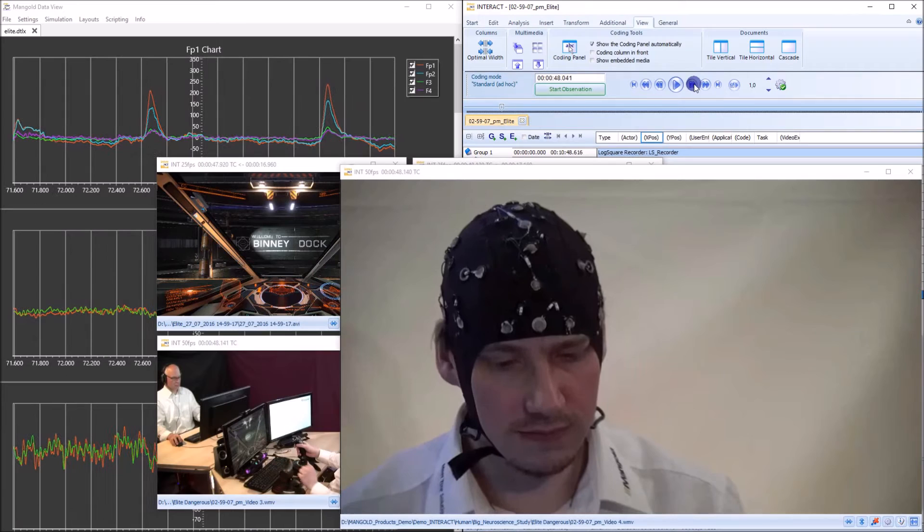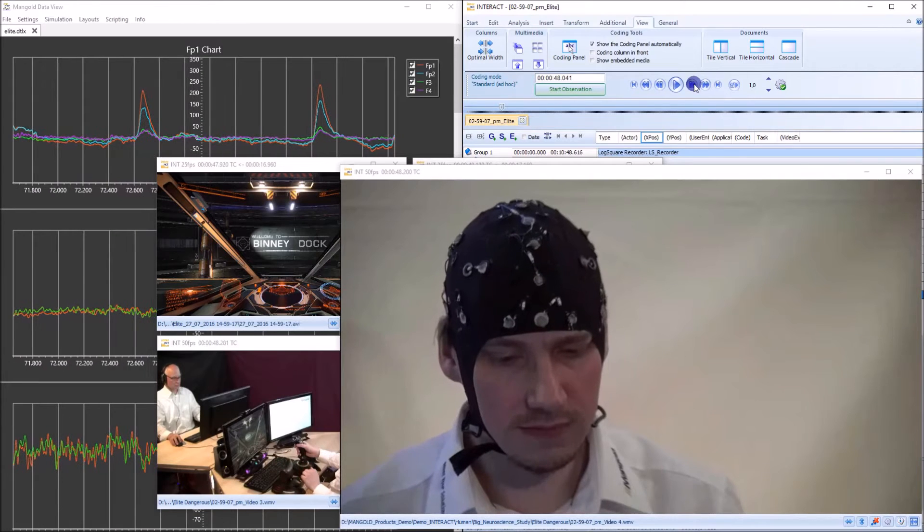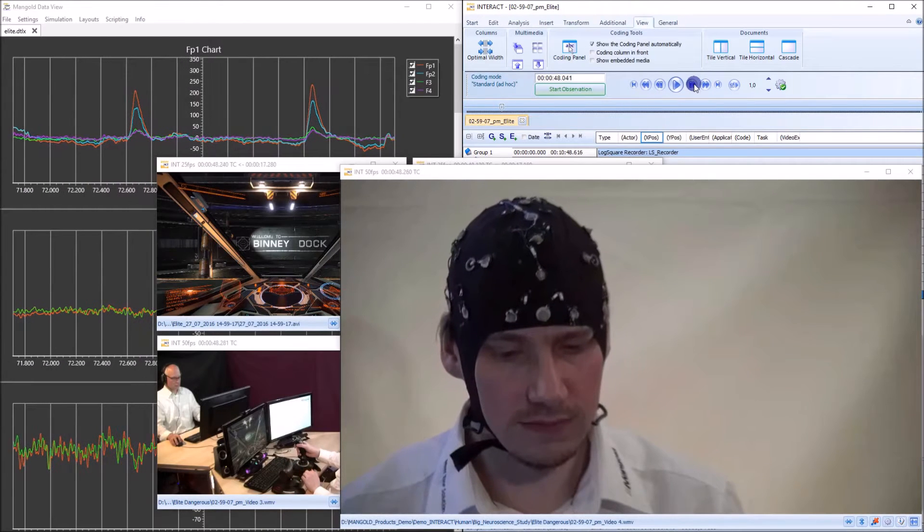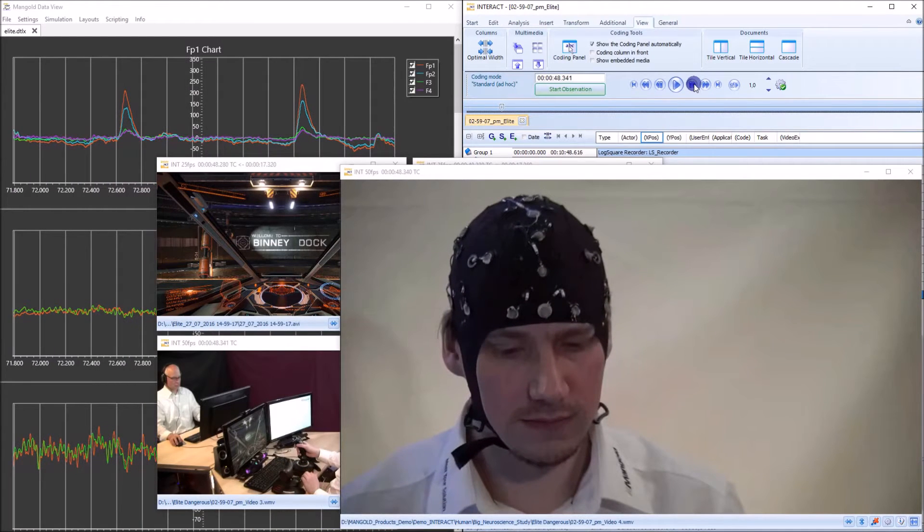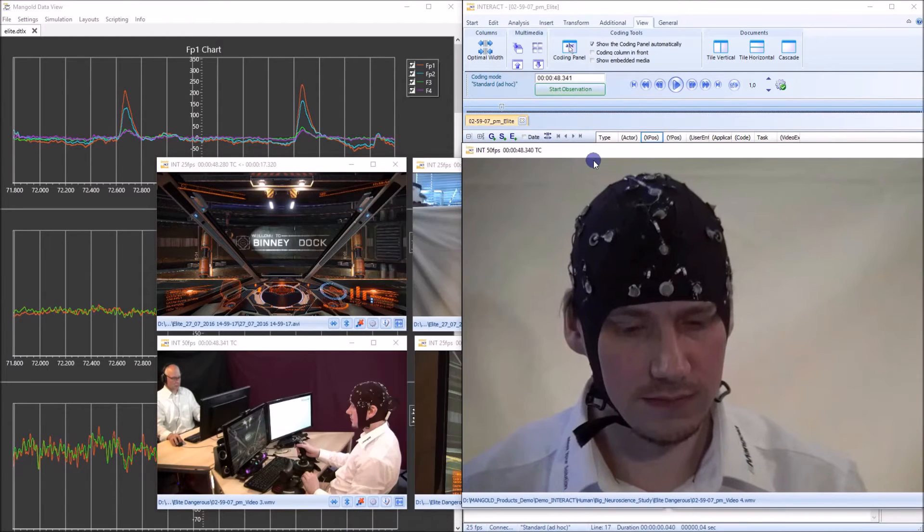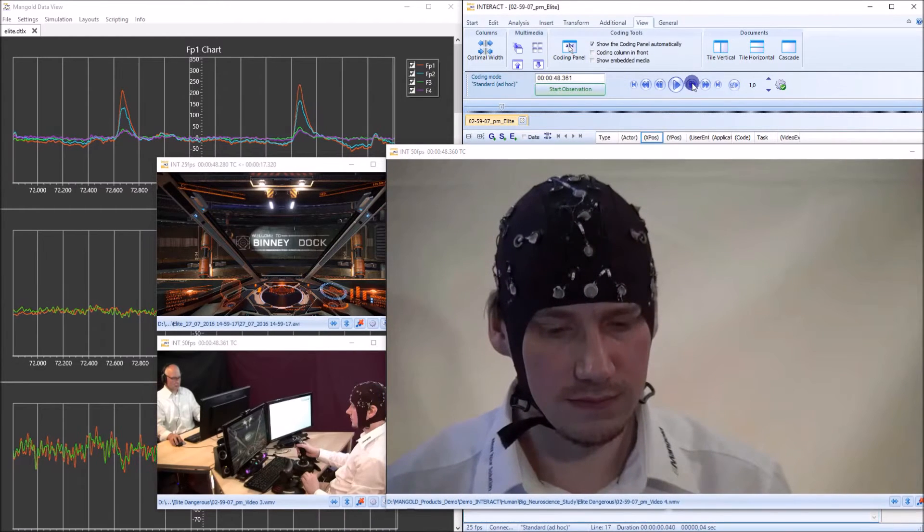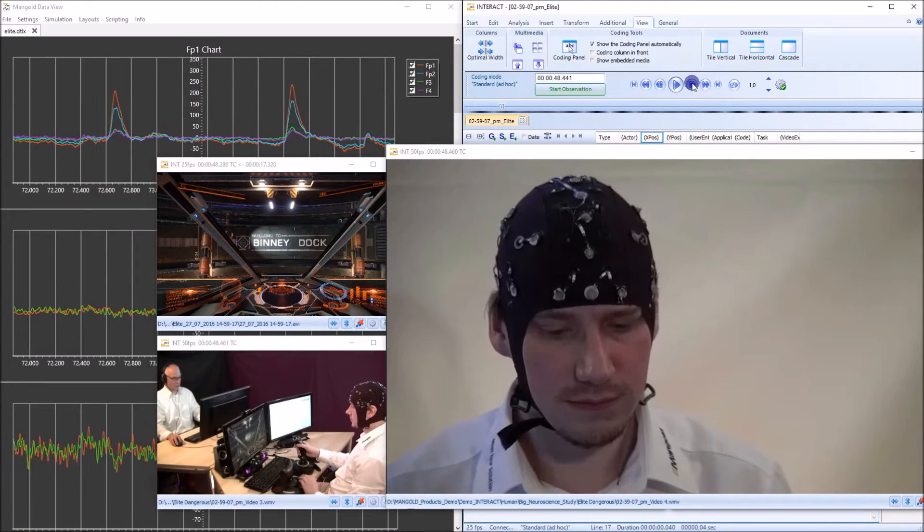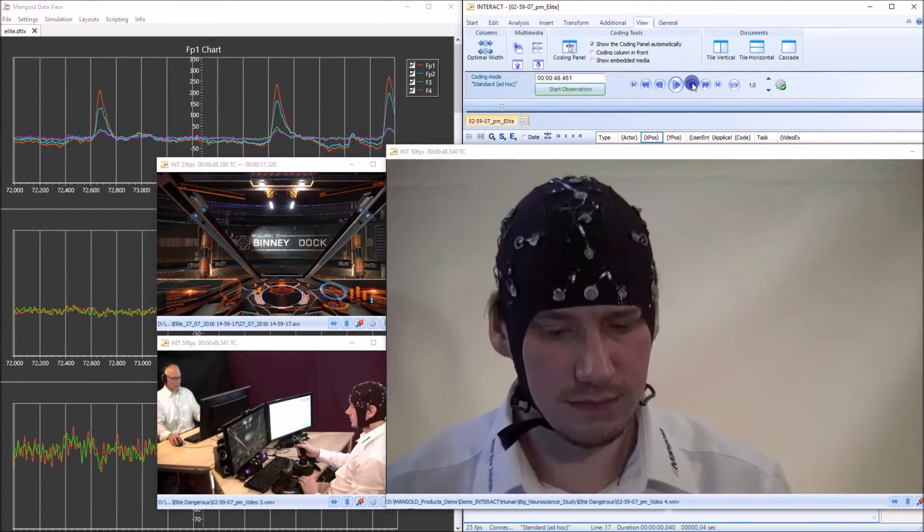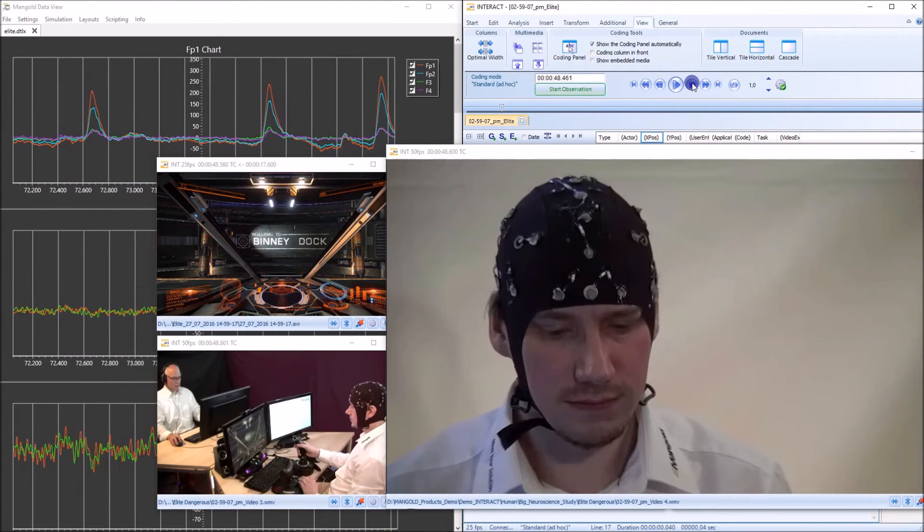I'm moving frame by frame through my data and you can see also here in the background that the other videos they stay in sync as well. Now let me move forward.